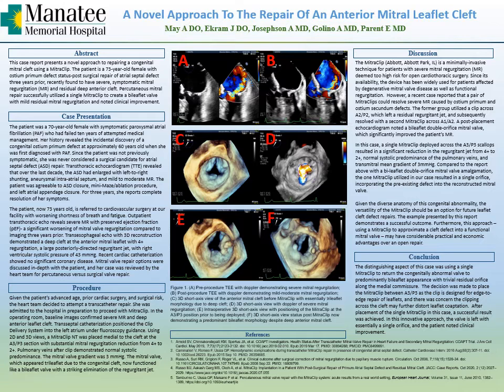An outpatient transthoracic echo revealed the presence of severe mitral regurgitation compared to the imaging that was done just 3 years prior. Follow-up transesophageal echo demonstrated that this regurgitation was 4+ with a large posterior regurgitant jet, and at the time her right ventricular systolic pressure was elevated despite her age and accounts for some of her presenting symptoms as well. However, her ejection fraction was preserved, which made intervention a favorable option.